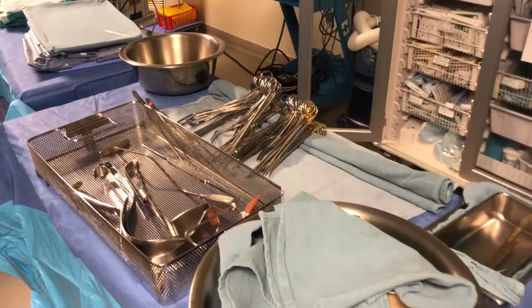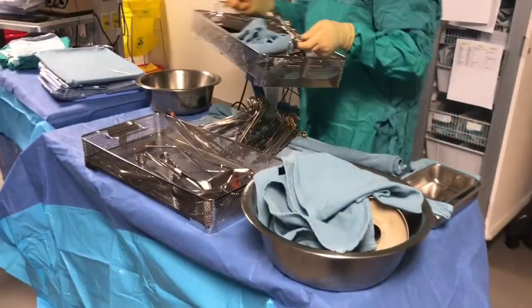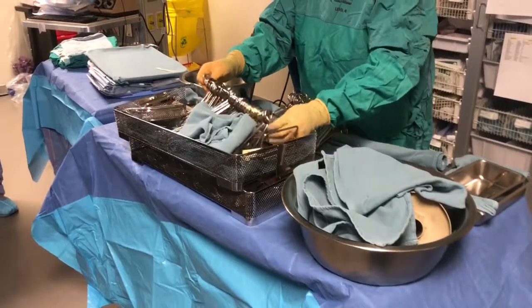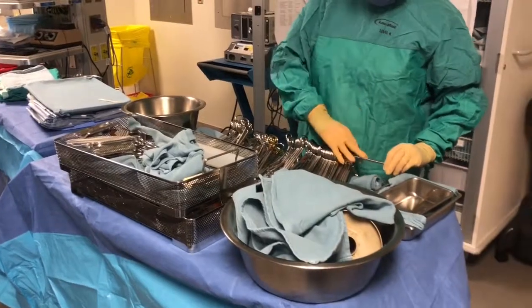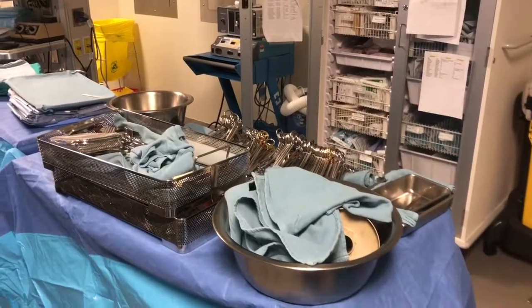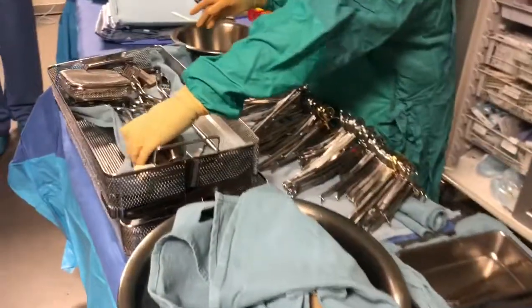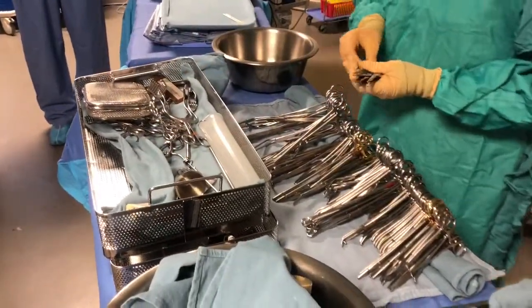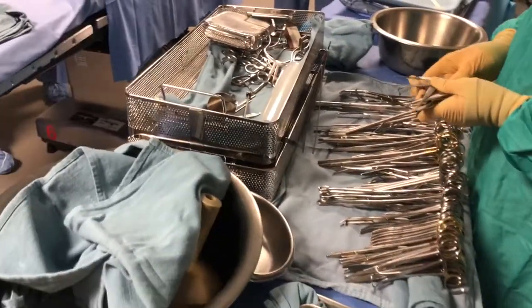Okay, and I'm going to throw this off because we're not counting that. Now the indicator, where is it? Oh, there it is. It's not fair. A lot of instruments. Is there a reason why you put it on the top of that one? Well, I actually probably should have put the small one out first, but it doesn't matter, as long as you're either one. Yeah. We don't have to know them for the test. What do you have to not know? These new instruments. You might.